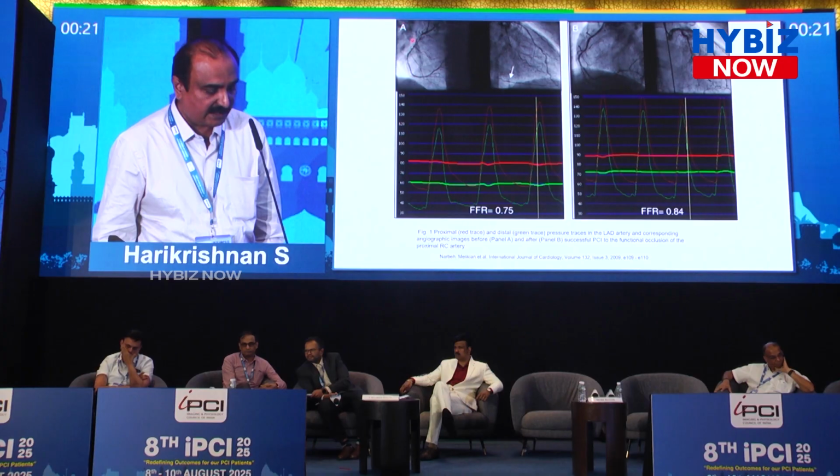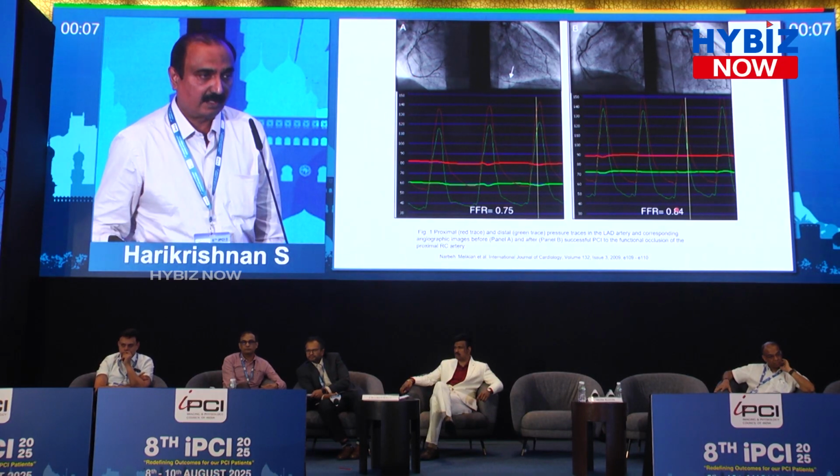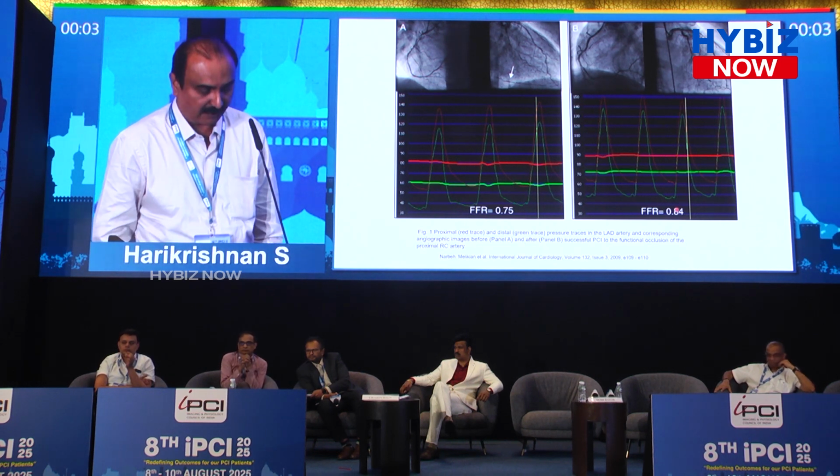So this RCA was 0.75. Sorry, the LAD was collateralizing this RCA, and the LAD FFR was 0.75. The RCA was revascularized. The LAD was measured again. You can see it has become negative. So the LAD was supplying the RCA. That is why the FFR was positive.